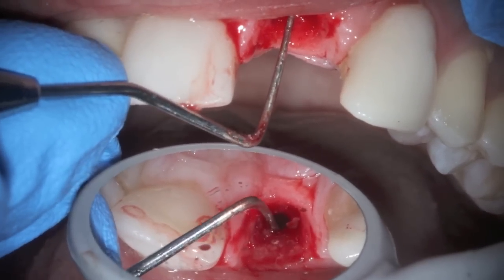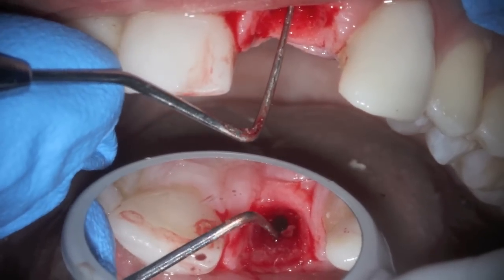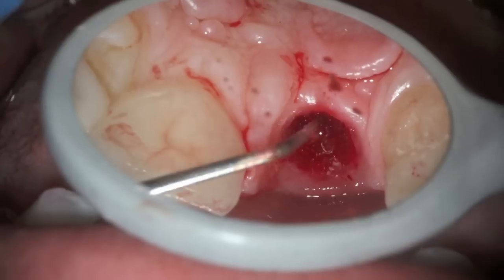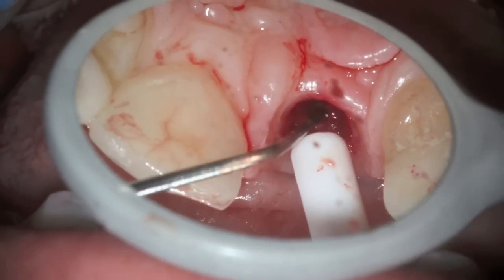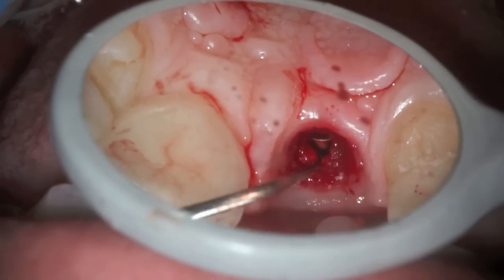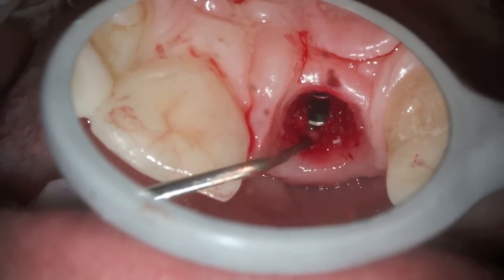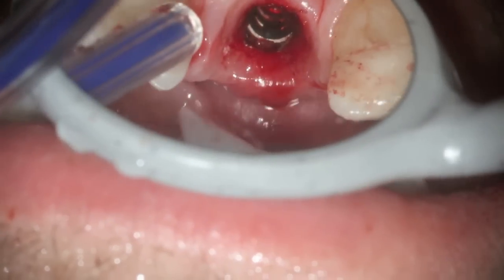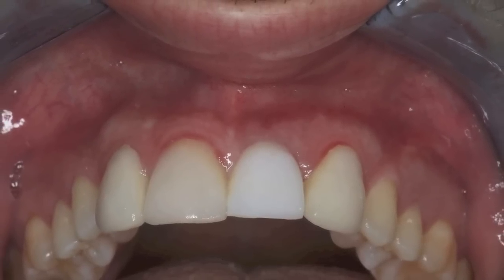In this case, you can see me measuring the bone around the implant, and everywhere was pretty nicely placed except for right on the buccal there, or the lip side, that there was a depression about 4 millimeters around the implant. Only maybe 2 or 3. This is after we removed the tissues, that you can see what was there.